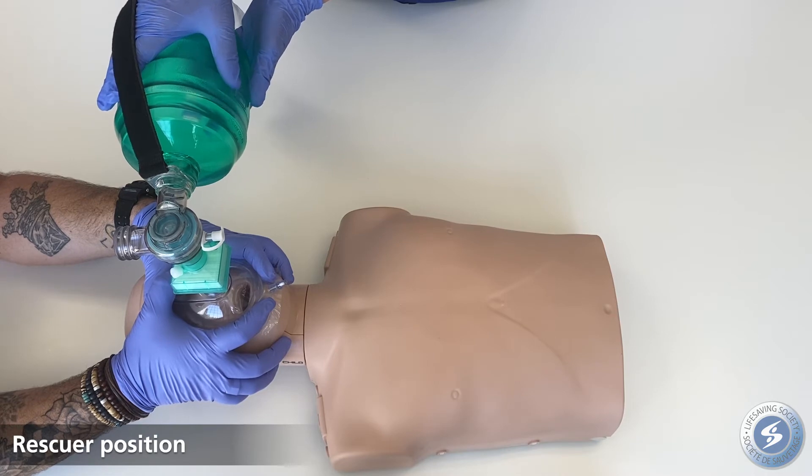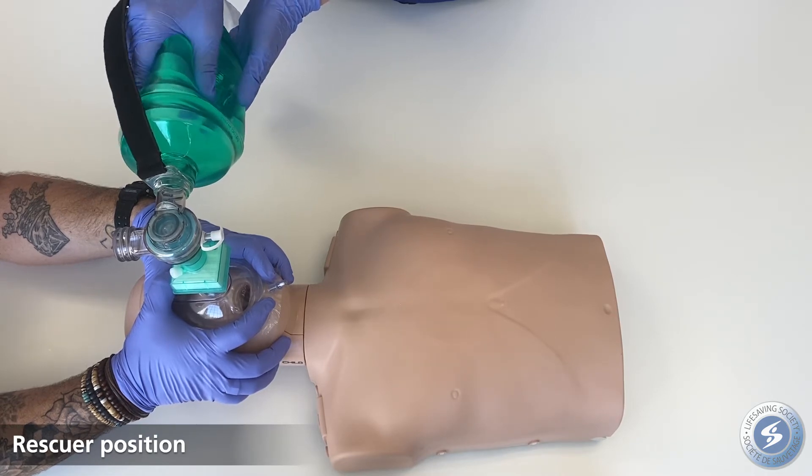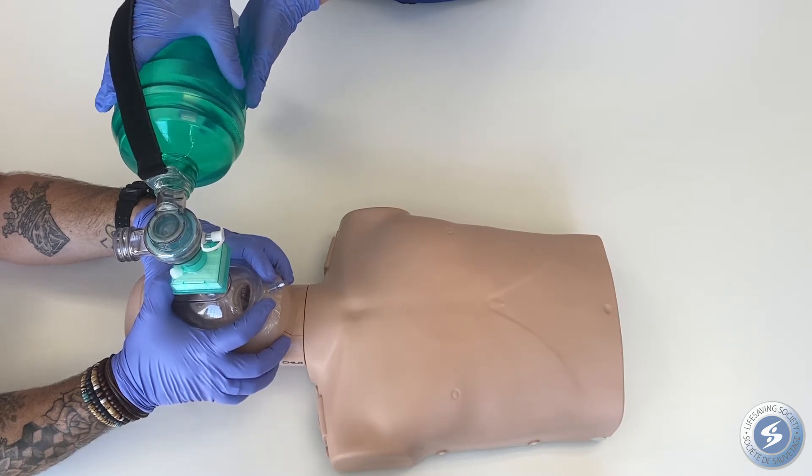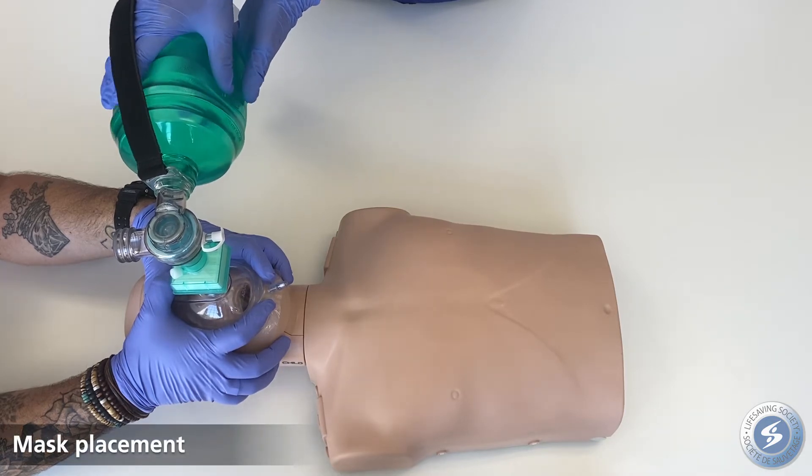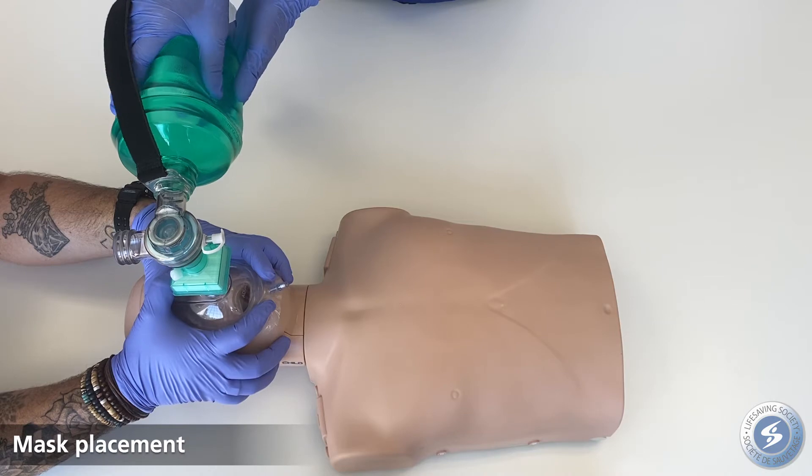Position the rescuer responsible for opening the airway at the head. Position the mask like a pocket mask, covering the victim's mouth and nose.